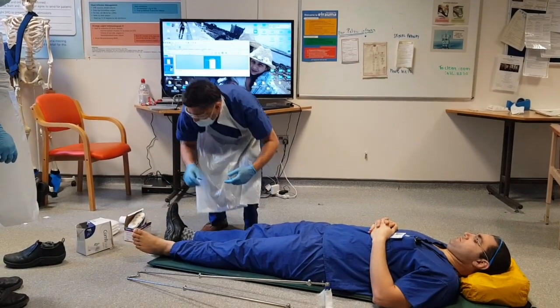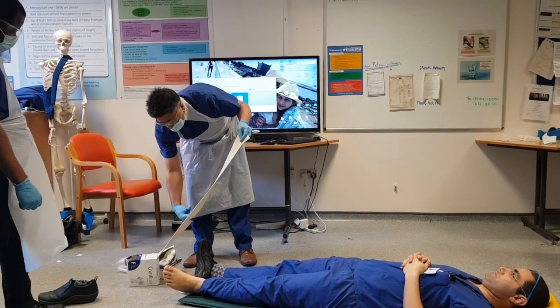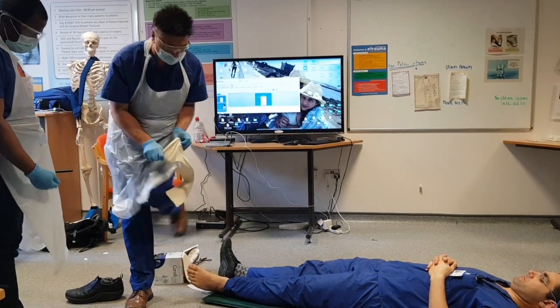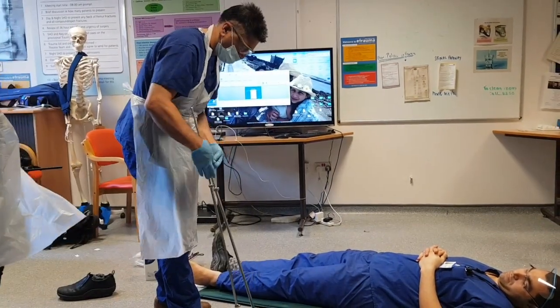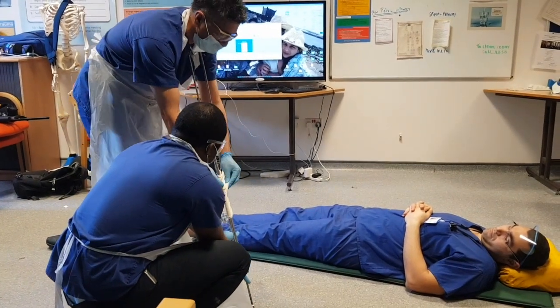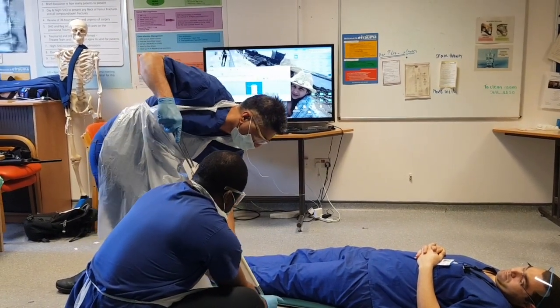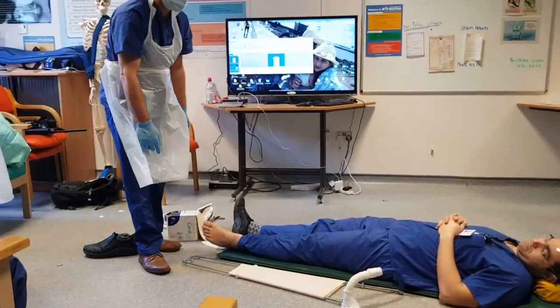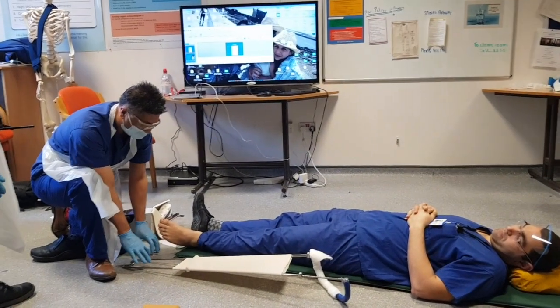We're just going to put this on for comfort. Then I'm going to put a length of tubigrip on the Thomas splint. We want it to be longer than the size of the patient's leg, because if that's on the ischial tuberosity and we want to get some traction, we need a little bit of room at the bottom.